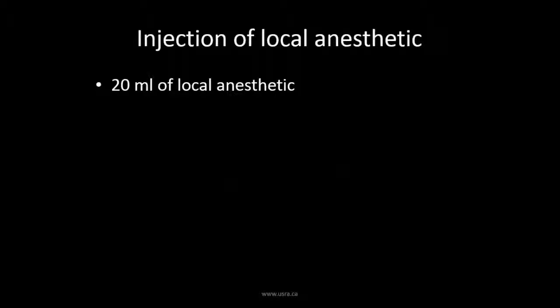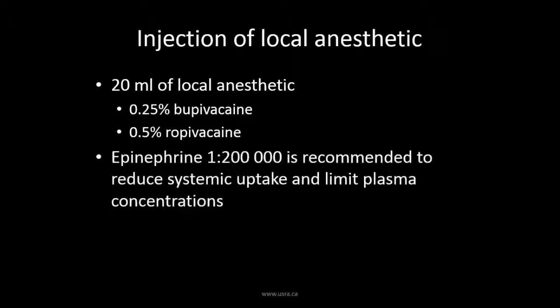A volume of 20 ml is generally recommended for injection. For analgesic blocks, a dilute long-acting local anesthetic such as 0.25% bupivacaine or 0.5% ropivacaine may be injected. It is recommended that epinephrine be added to the local anesthetic solution to limit plasma concentrations and reduce the risk of systemic toxicity.